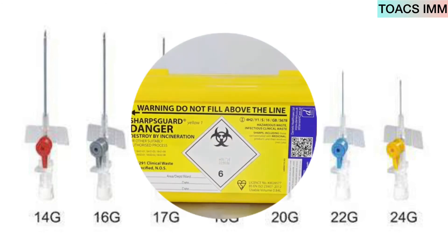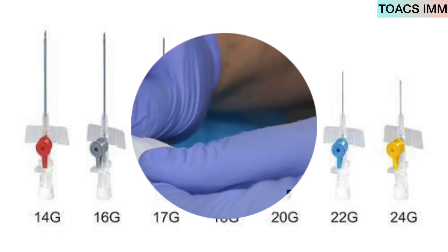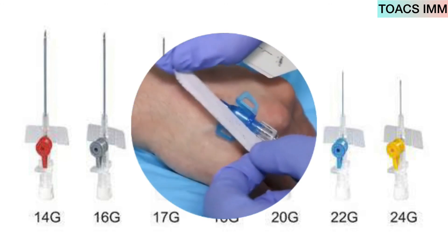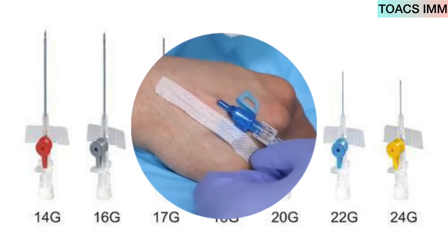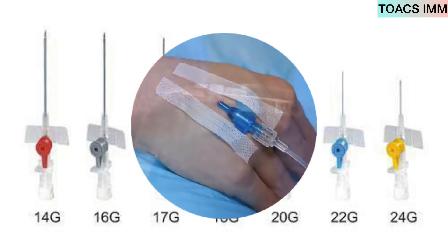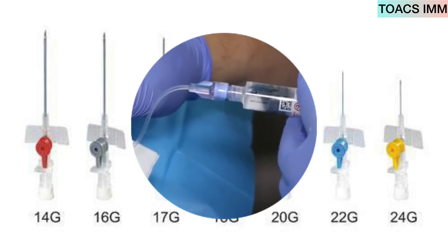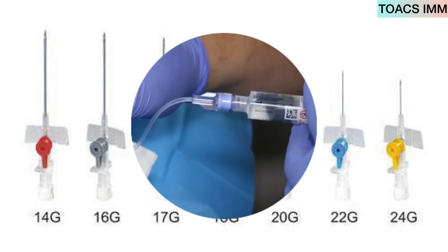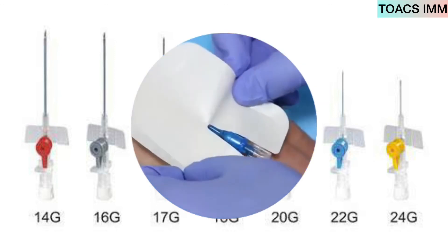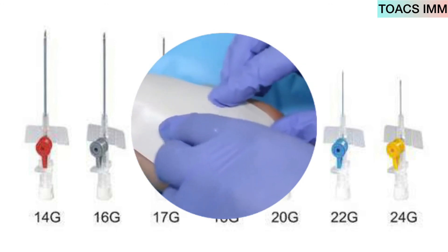Attach the extension set, then secure the cannula with dressing. Flush the line with normal saline to confirm the cannula is in working order. Once confirmed, cover it with the dressing.